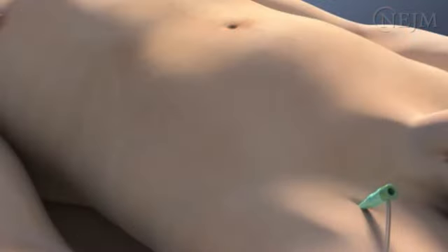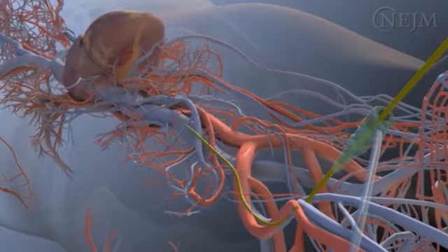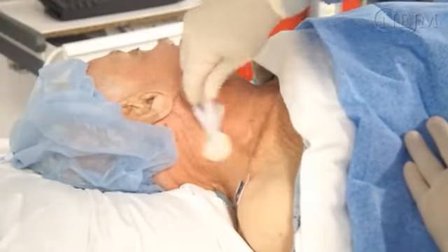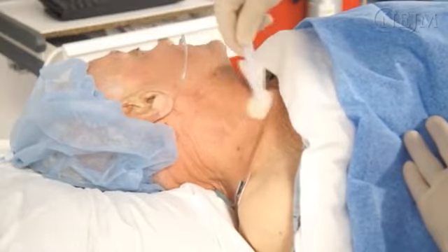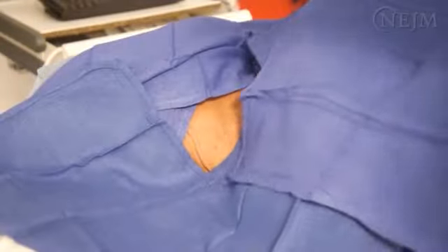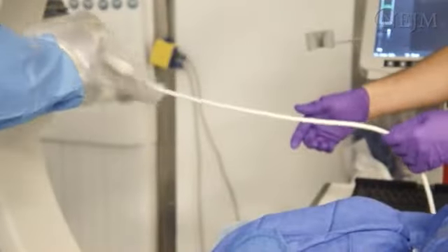Advancing the catheter from the left internal jugular vein, right subclavian vein, or femoral vein as shown here can be more challenging and often requires fluoroscopic guidance. After thoroughly washing your hands and donning the sterile garments and sterile gloves, prepare the skin over the vein with chlorhexidine. Place the sterile towels and drape over the patient. Cover the ultrasound probe with the sterile sleeve.